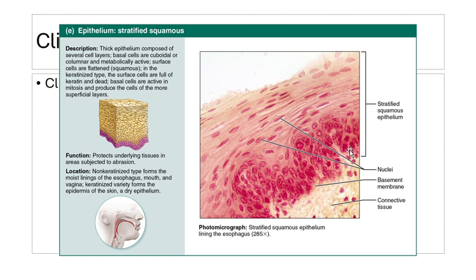So this basal cell layer is cuboidal. But when we go through to the surface of these cells, the cells become more flattened. So at the top surface, we can see more flattened cells. Because of that, we call it a stratified squamous regarding the top surface cells.